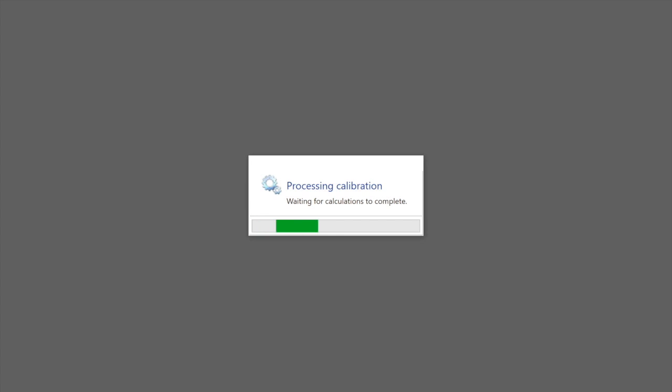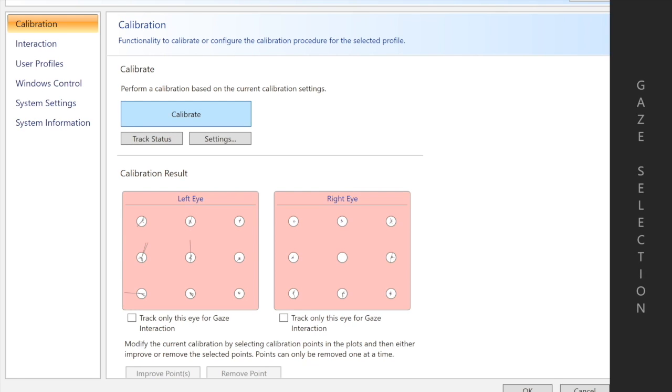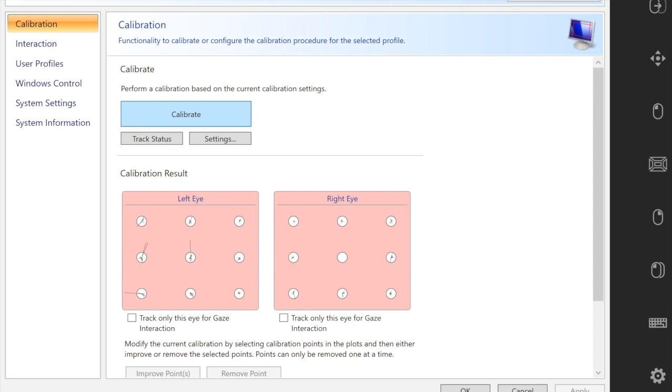Once it is done, you will get calibration results. Now I looked away during one of those calibration tests so that it will give me an imperfect set of results. Once you see these results, you will see that there is a missing calibration point and a couple that are slightly skewed on the left eye.